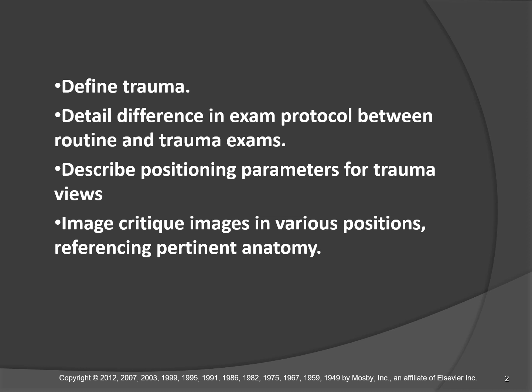And most of our positioning that we've been taught so far is you have to push and pull and twist and rotate and communicate with your patient, obviously, but you have to manipulate the part into a certain arrangement so that it demonstrates the anatomy nicely. And if you don't get it just right, well, then you have to repeat it because it's non-diagnostic.